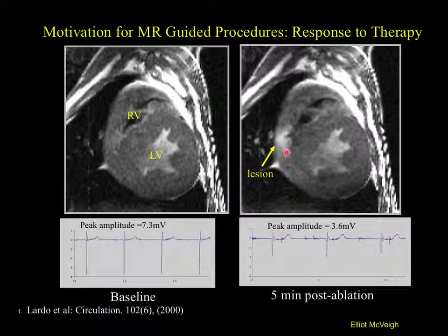But remember, this edema on the outside here causing this increased signal might come back to normal, right? It doesn't mean the tissue's dead. It just means it's edematous. And so there, you need to know the penumbra of the edema expected when you do this kind of burn.